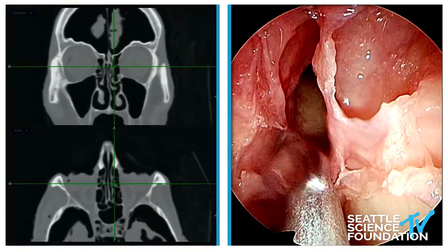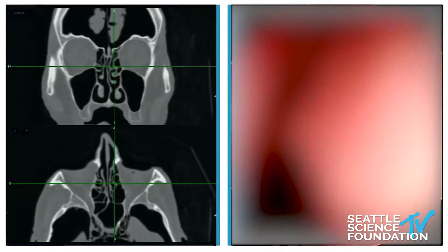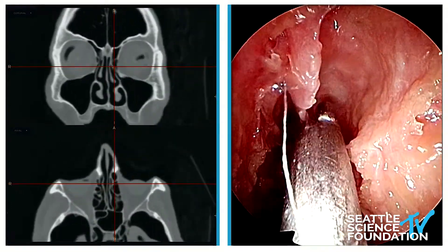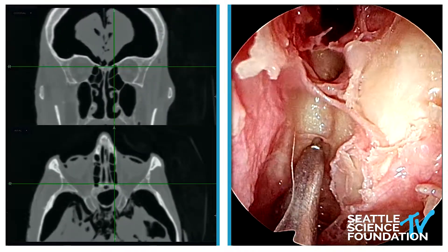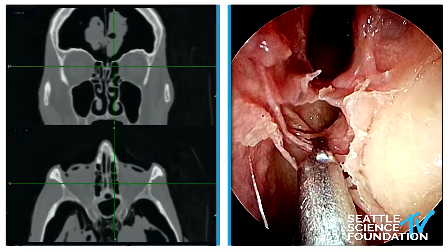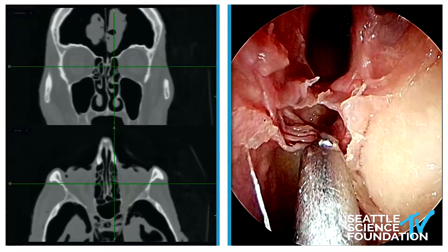The two tools I just want to show you are that when you are doing this, it's all about the setup of what you're seeing. When we go and look up, everything is projecting us to look more anterior and take this down. Find the posterior ethmoid skull base, come anterior, anterior, anterior, until such time as it starts to turn up. That is where the anterior ethmoid artery is, and we can see it in this actual dissection — it's hanging, and Winston cut through it, but it's hanging.